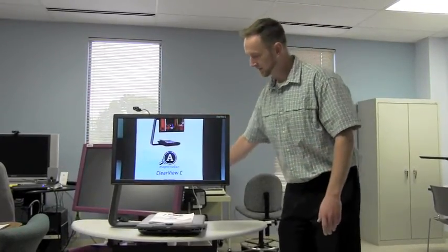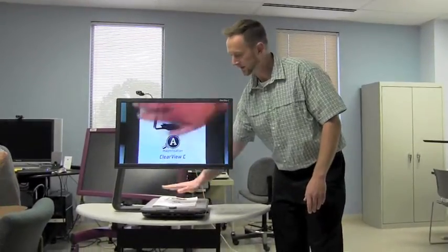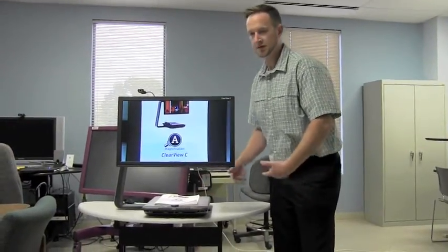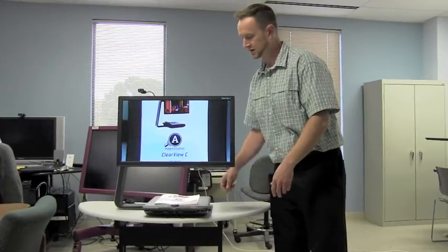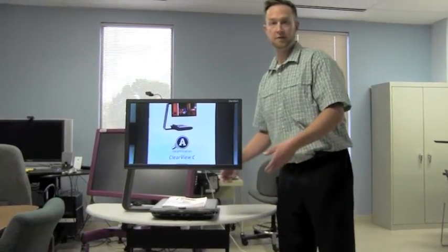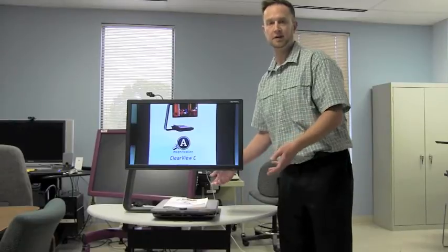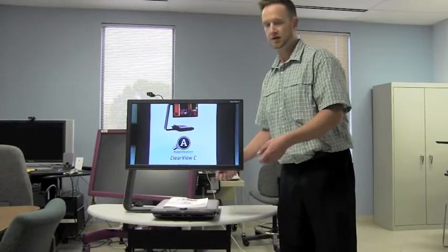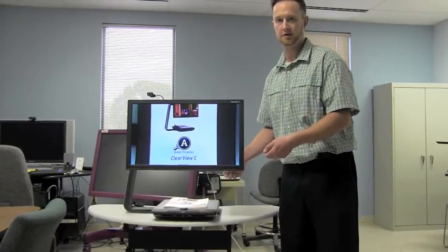As you can see, with this C frame, you have all of this space here. So it creates a much more open environment for you to be able to read your materials. If you have a newspaper that you want to fold all the way out, a complaint that we've always heard throughout the years, it's very difficult to fold up a newspaper and put it under traditional CCTV.